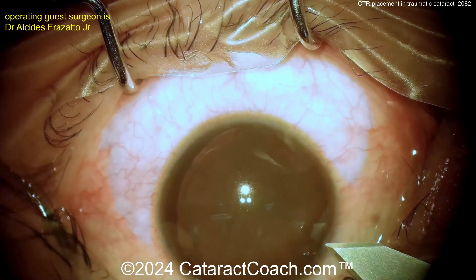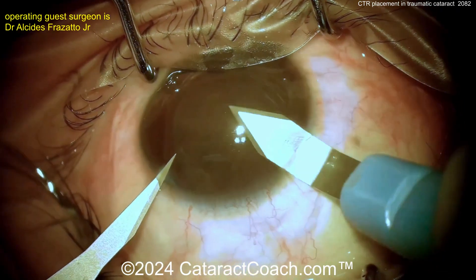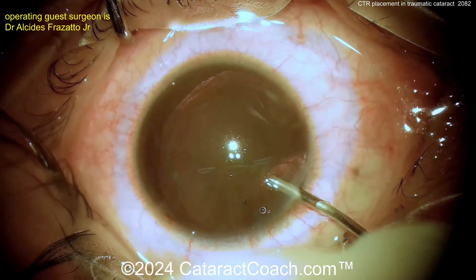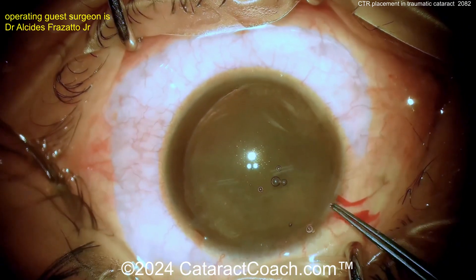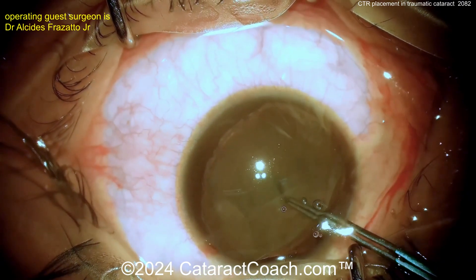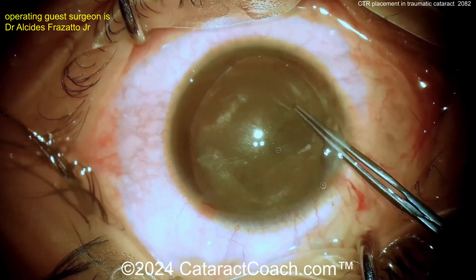The patient has some trauma here, and you can see it looks like some zonular dehiscence, maybe on the left side of the screen. The surgeon is making the main incision and the paracentesis, going in with viscoelastic. It's hard to tell — is that a lamellar cataract, or is there a gap in zonular support? Where's the iris? Is it that dilated — is it traumatic mydriasis? There looks to be some zonulopathy.